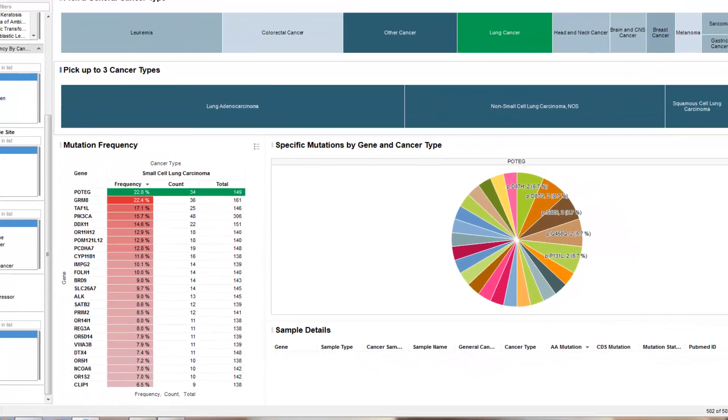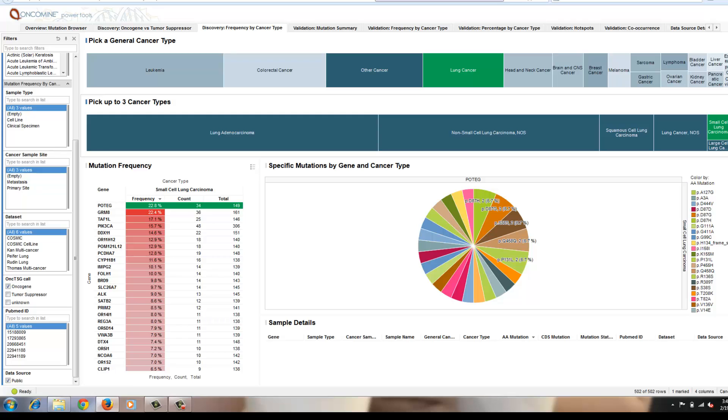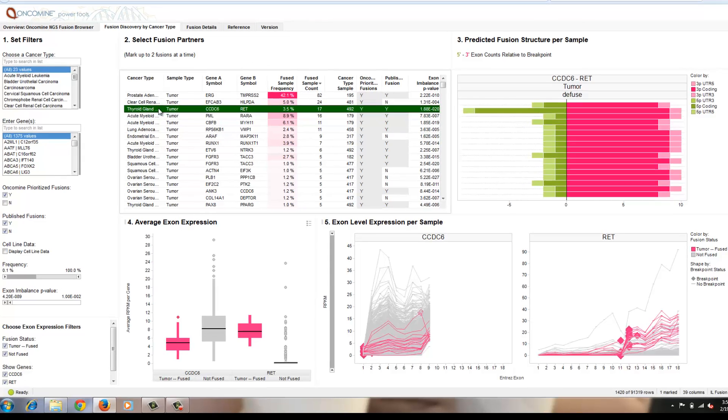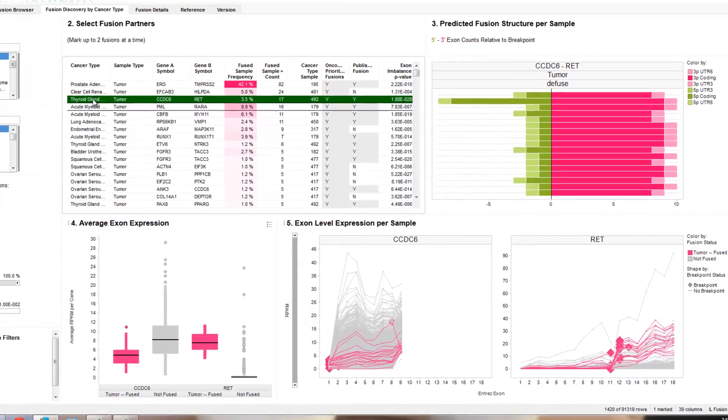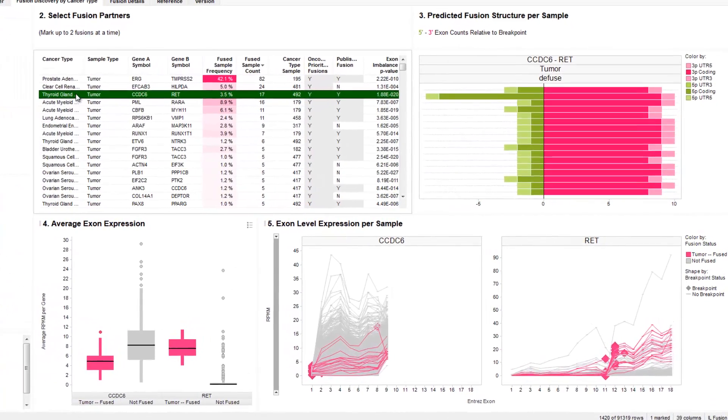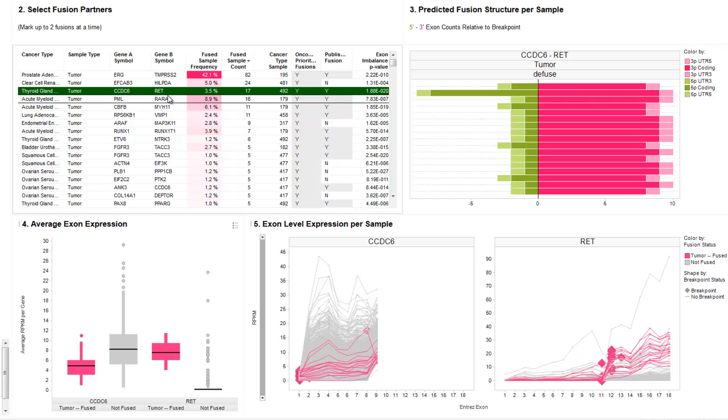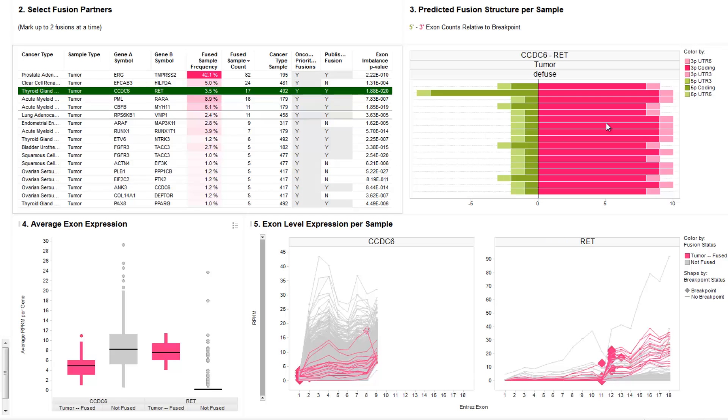Finally, the Oncomine next-gen sequencing power tool suite provides views on data types such as fusion data. These fusions are called through our pipelines and summarized here in this cancer type view. Here, we're highlighting thyroid gland tumors and a particular fusion that was identified, CCDC6 and RET at a frequency of 3.5%. And we're also retrieving each of the individual patient and showing the structure of these fusions based on the exons to look for heterogeneity across these different patients and get a sense for the structure of the mutation.